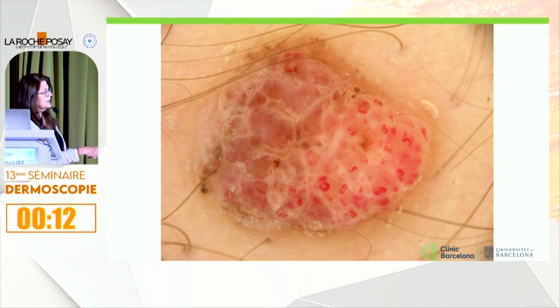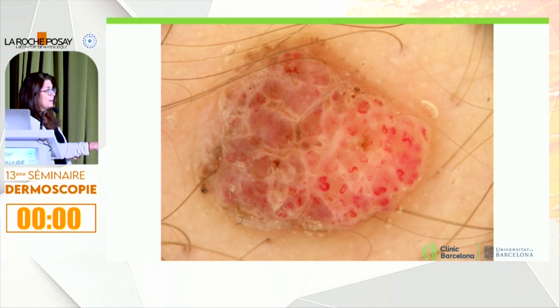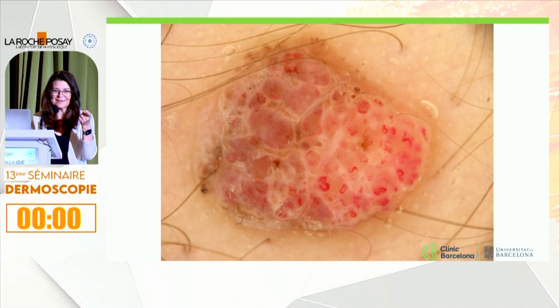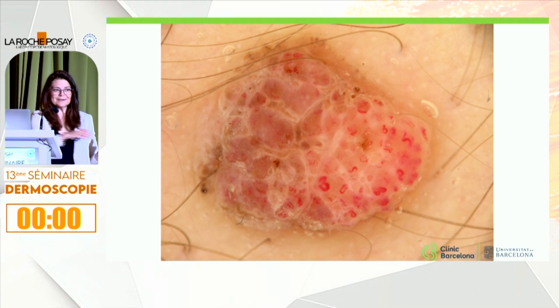What you see is these atypical vessels, some of them can mimic a comma, but some are very thick, others very thin. We call them polymorphous vessels. Also, we see here milky red. It's pink. Usually dermal nevi are the normal color of the skin, not pink. If you see pink with vessels and remnants of pigmentation with some globules here, do you see them? Then you already said it could be a Spitz. Spitz tumor. I don't know if it will be a Spitz nevus, a Spitz tumor, or a Spitz melanoma, but it is in the range of a Spitz.